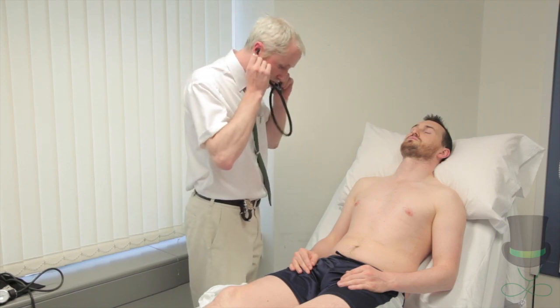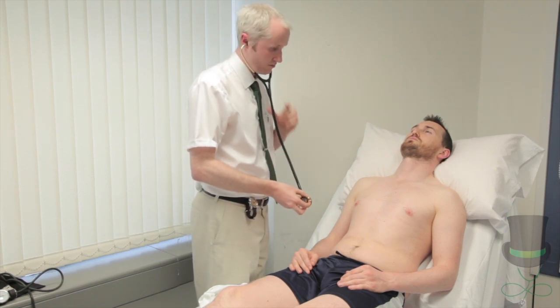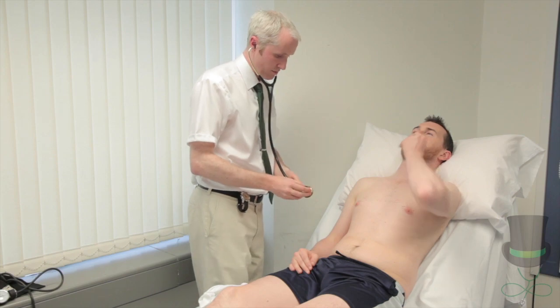Here is a smoother, more integrated exam where accentuating breathing exercises and dynamic maneuvers are integrated into the exam.